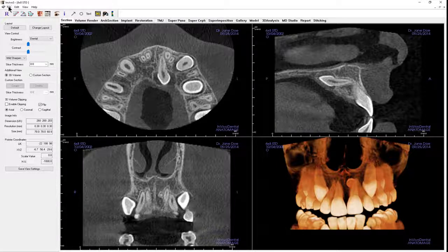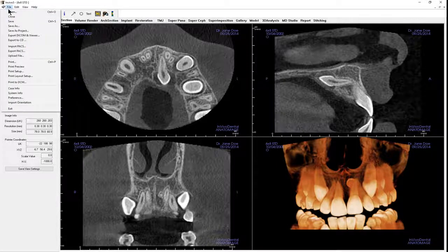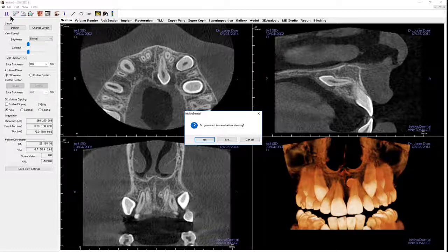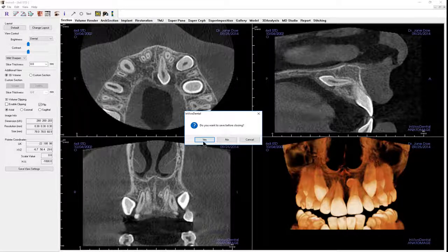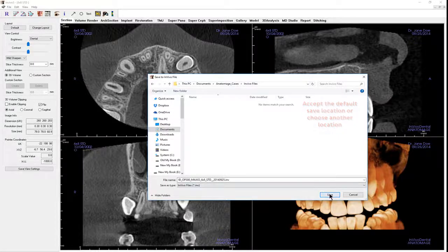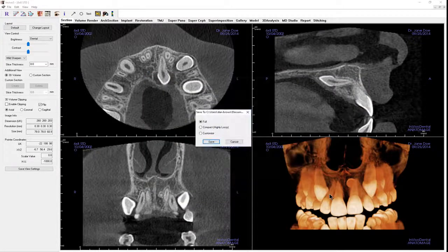After looking at a scan in in vivo and before it is closed, you will be asked if you want to save any changes that have been made. If you select no, a new file will not be created and any changes made will not be saved. If you would like to save the file, select yes, select a save location, and generally accept full or uncompressed.